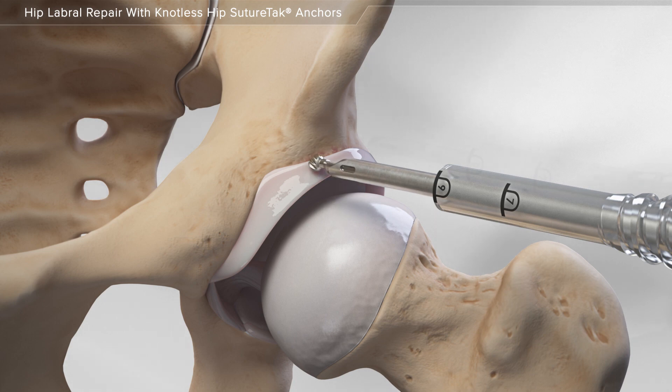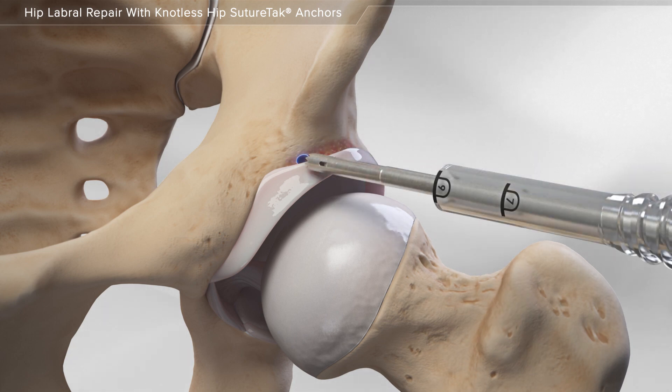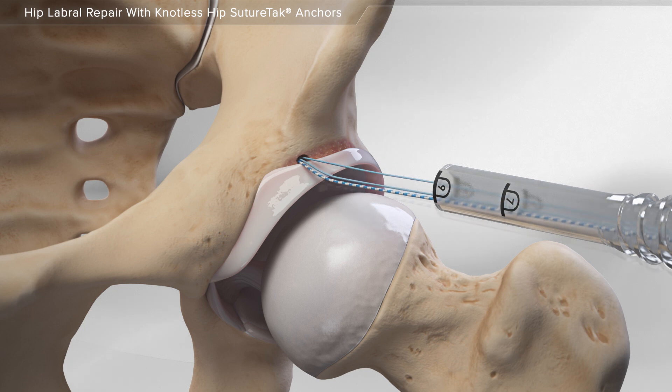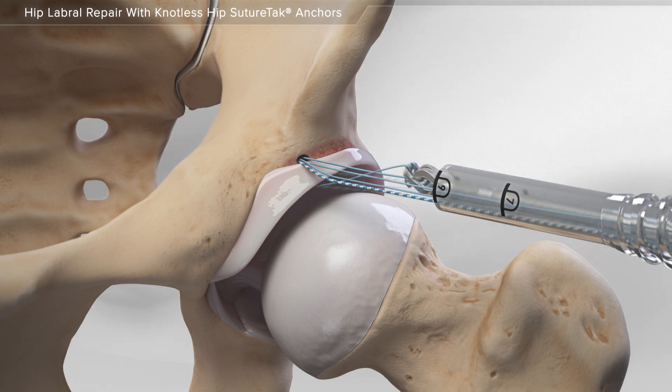First, your surgeon uses a series of instruments to prepare the bone and creates a hole in the acetabulum. A knotless suture tack anchor is placed through the guide and into the hole. The suture attached to the anchor is placed around and then through the labrum.